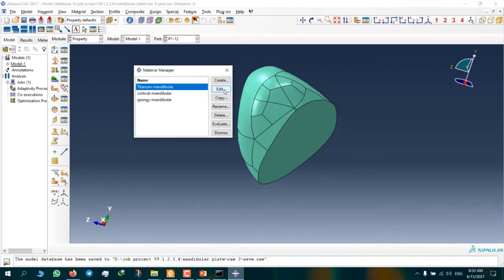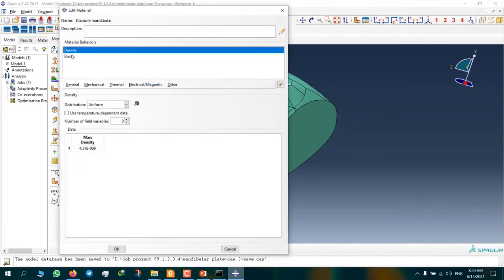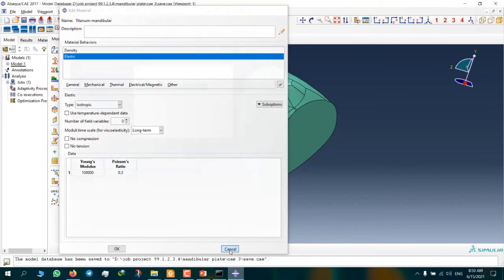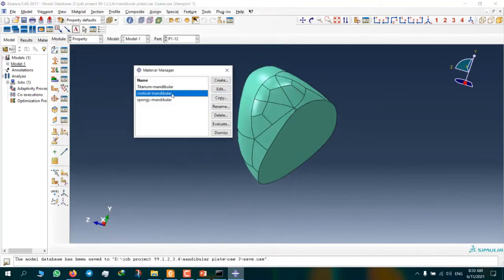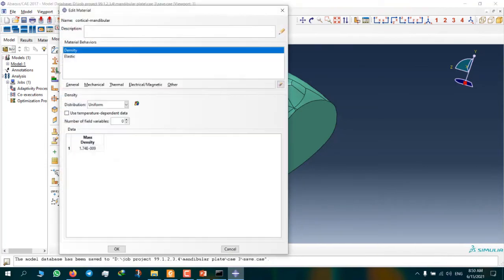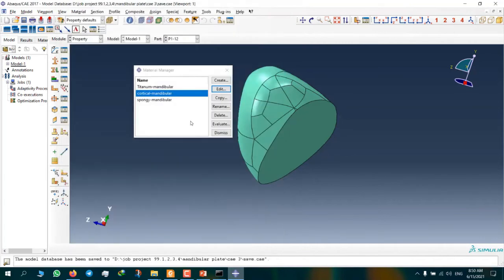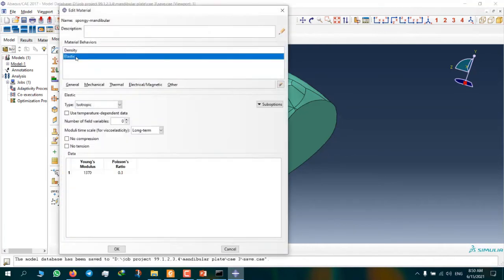Here we have material properties. This is for titanium alloy, this is for cortical bone, and this is for spongy bone.